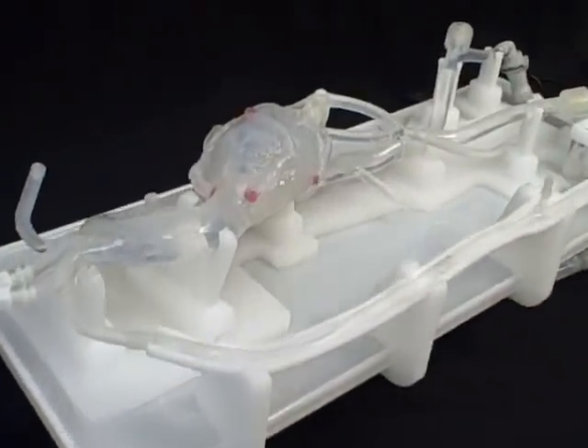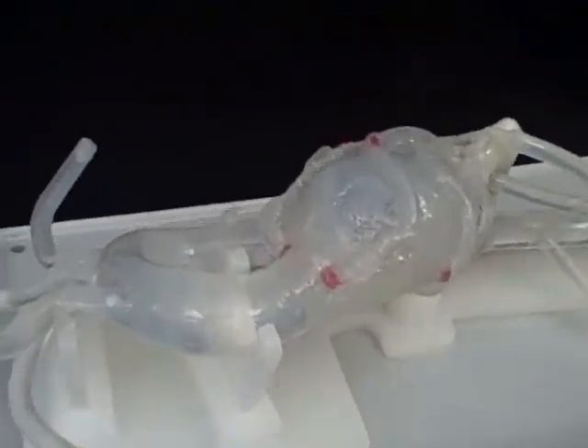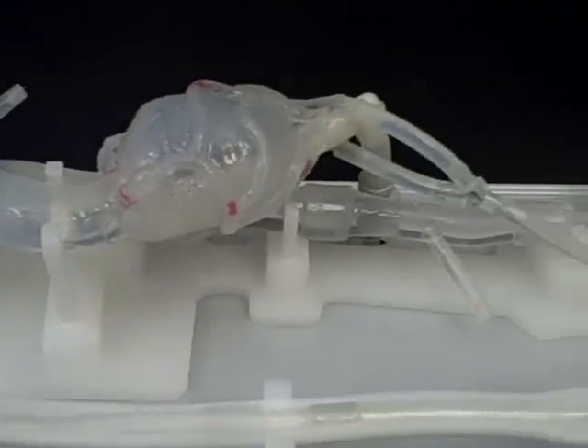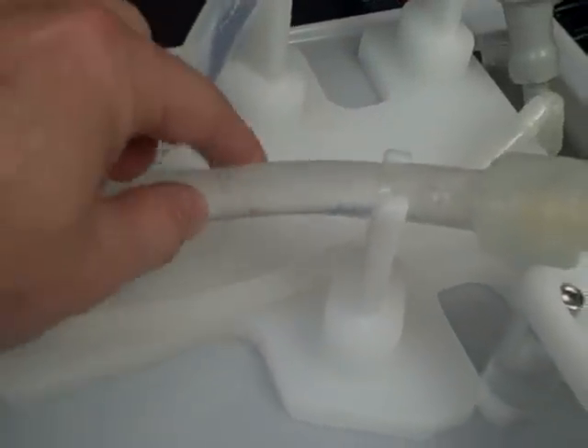This model is made of a 30A durometer silicone. It's translucent and is being constrained in certain locations so vessel movement is possible as the catheter is actually tracked down the anatomy.